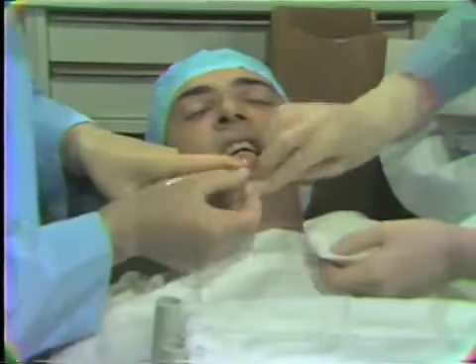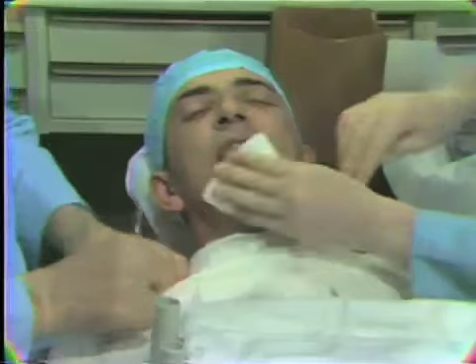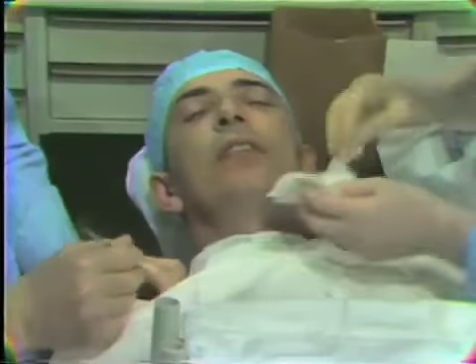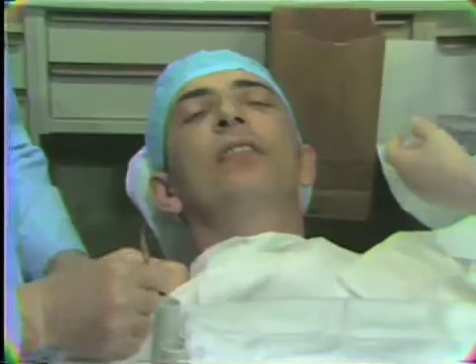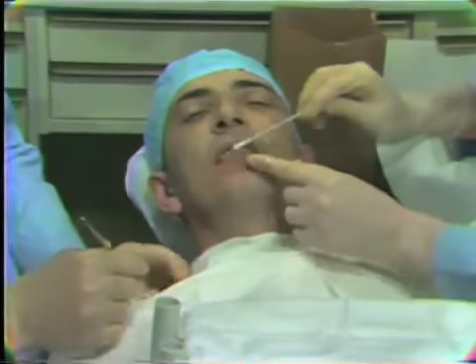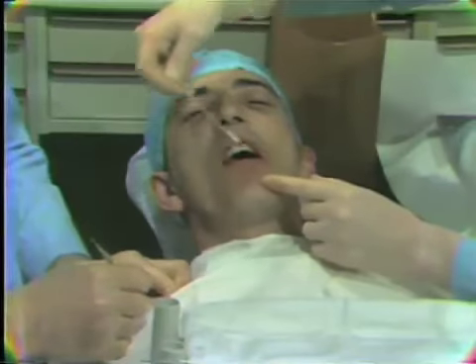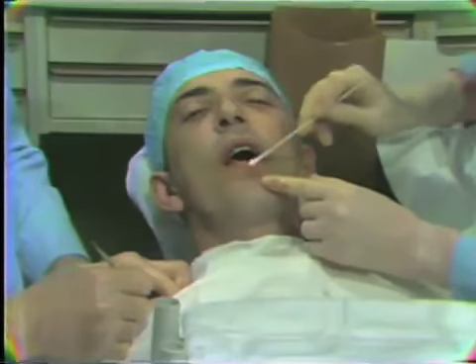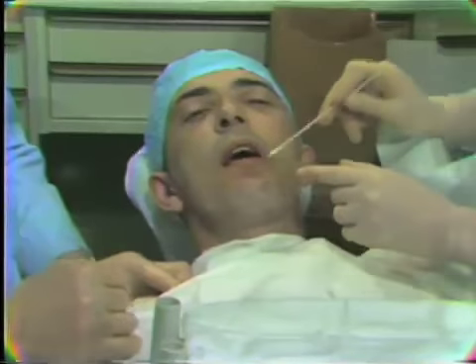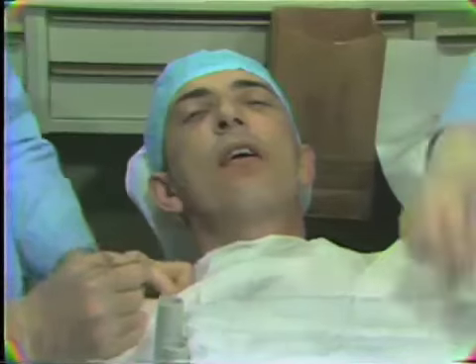Our surgical procedure at this point is complete. The assistant can carry out the final cleaning procedures for the patient's face. We will be following the patient during the healing process over the next several weeks. A final application then of Vaseline or petroleum jelly to the patient's lips, helping to lubricate the lips that we have retracted and done some pulling and stretching of during the course of the procedure.